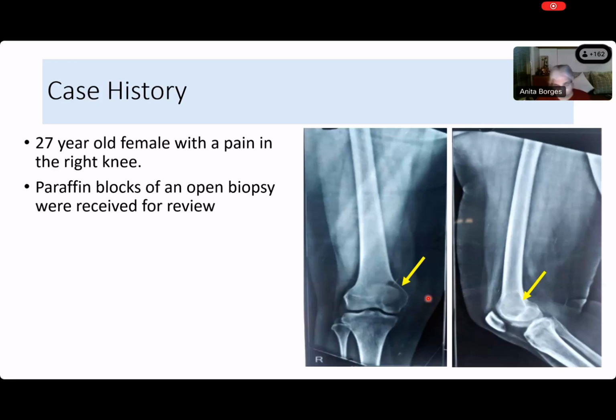Very good. So now, what would be your possible differential diagnosis? It's unlikely to be a giant cell tumor, right? Yes, ma'am. Why? Because it's not got internal septations. So what is the other tumor that occurs in the epiphysis in a young individual, in the femur, very commonly, and that has this kind of appearance? Anybody? Because all of you have seen this, shown it in your departments, gone to the X-ray department. Anybody saying anything in the chat box, Saloma?